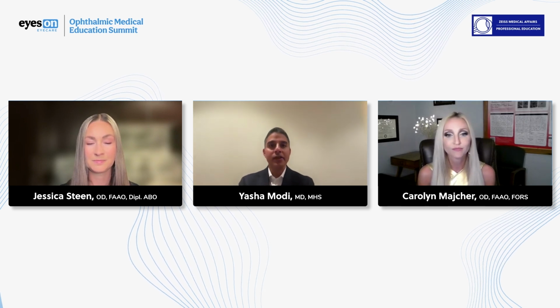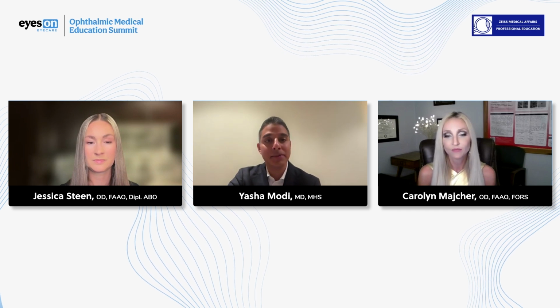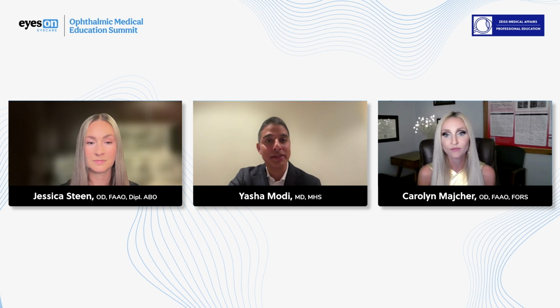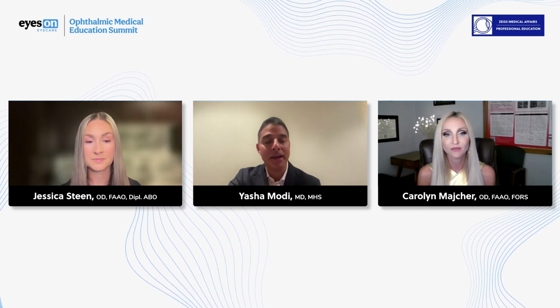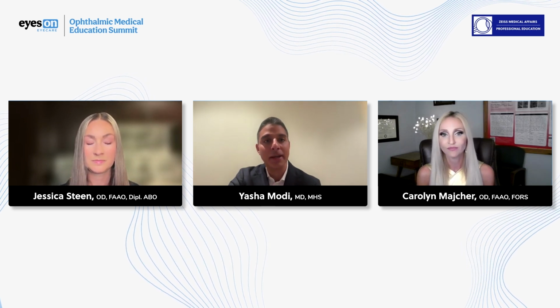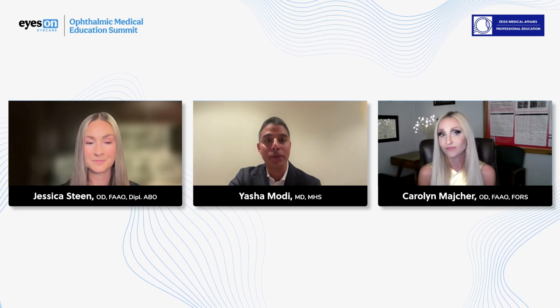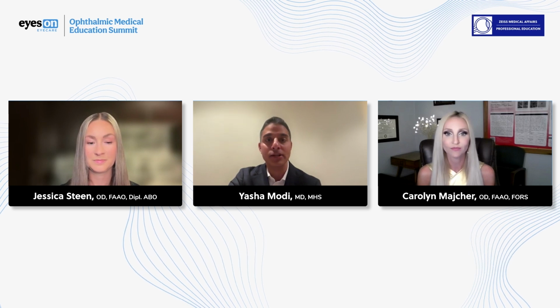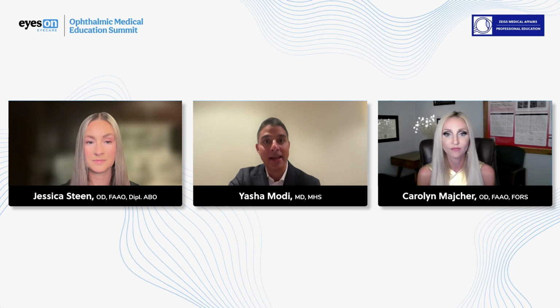Yeah, and the other thing which I love is that you're following these patients over time. And so sometimes, a patient may be in Dr. Steen's clinic for like 4 years and then show up to my clinic for the first time. And understanding that change over time can be really, really valuable. So I can almost imagine a teleretinal communication where you're sending over the progression, the GA analysis, the distance to the fovea analysis, and that can be very actionable for me on my end.